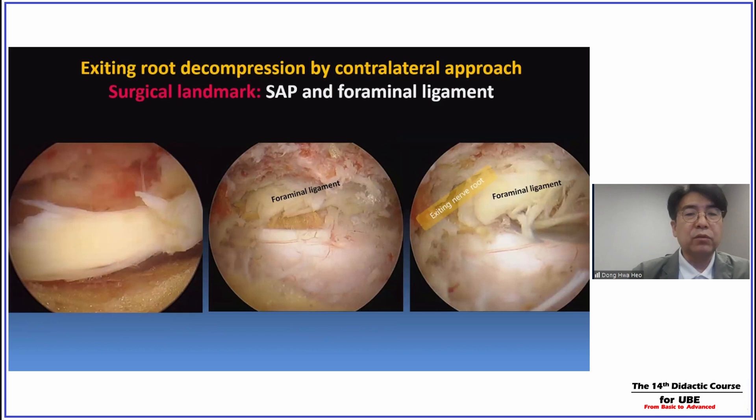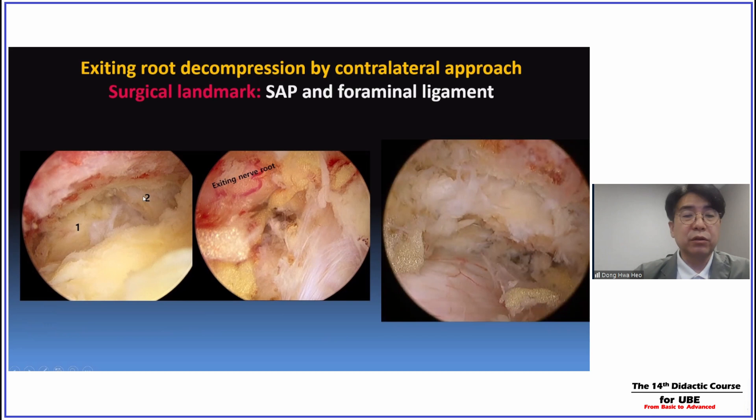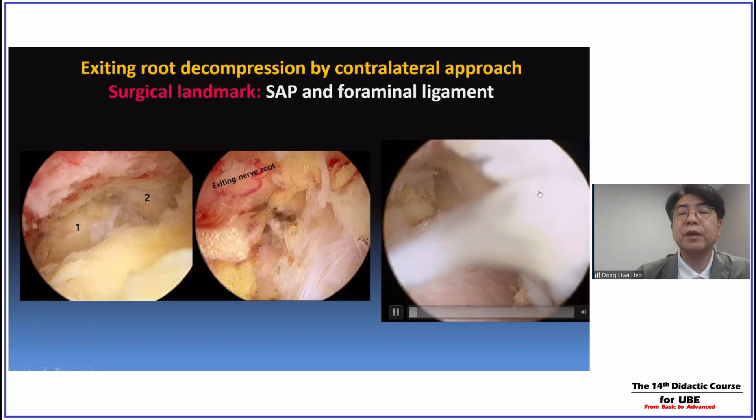We have to find two surgical landmarks, which are very important for successful and complete decompression of the contralateral side. First is the contralateral ligamentum flavum. After removal of the ligamentum flavum, we have to find the foraminal ligament and the SAP. You can see the foraminal ligament, and you can see the medial border and the tip of the SAP.